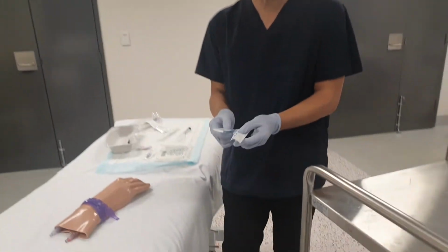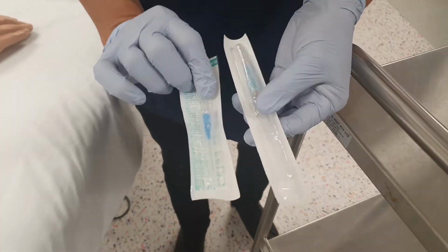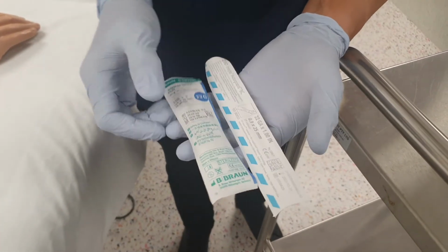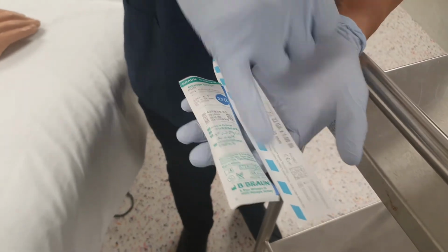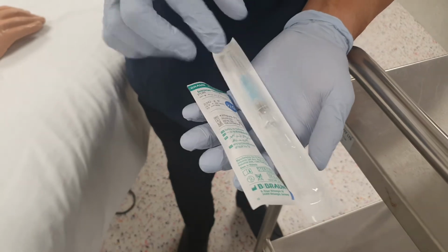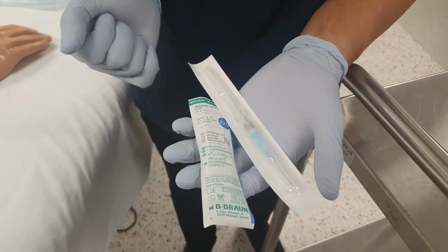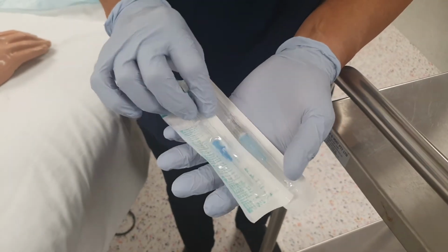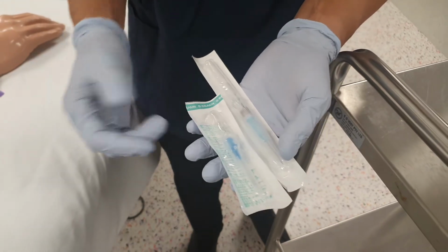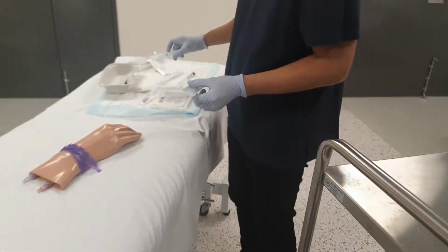I just wanted to show you this really quickly, okay? There's different types of cannulas, and we've purchased different types of cannulas just so that you can get exposure to them. See these striations here? These striations mean that the cannula has a valve, and they're really nice and really luxurious because the valve will stop blood from leaking back, and it's awesome. And this cannula doesn't have a valve there, so this cannula is going to leak a lot of blood everywhere, which means it's going to be a mess. And I want to use this cannula today, I think.